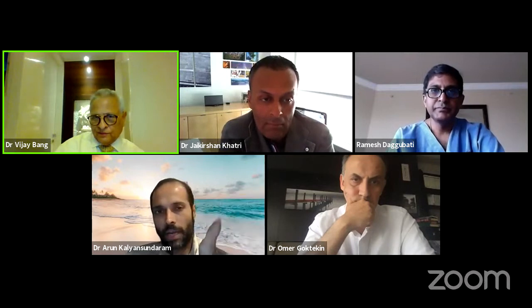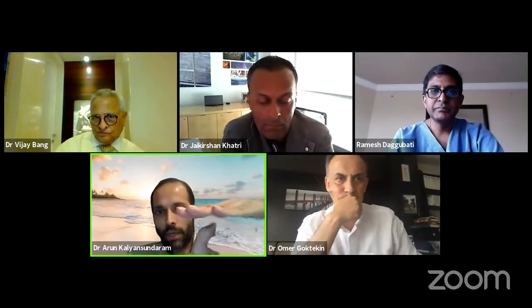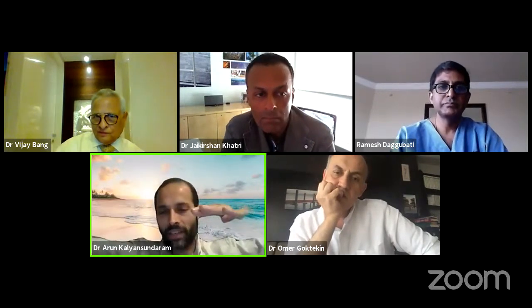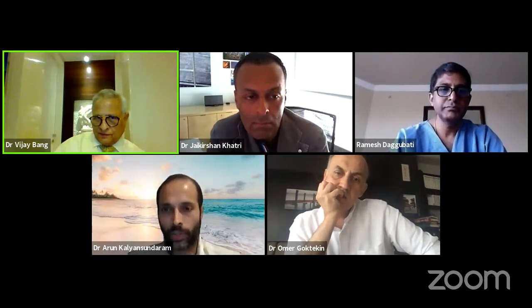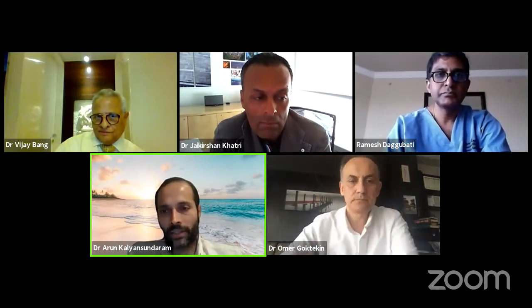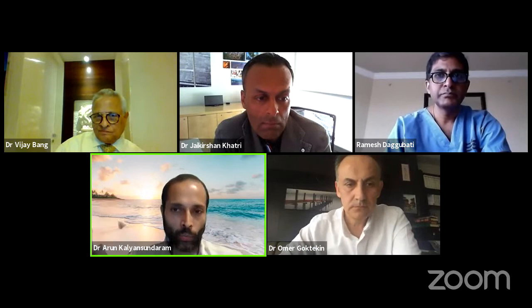If this is the lumen and the balloon is this way, one hole will be towards the lumen and the other hole will be towards the adventitia. That's the whole idea of using a Stingray balloon. You don't control how it, I mean, you could pull it, move it, etc. So don't get dogmatic on where you want to re-enter.